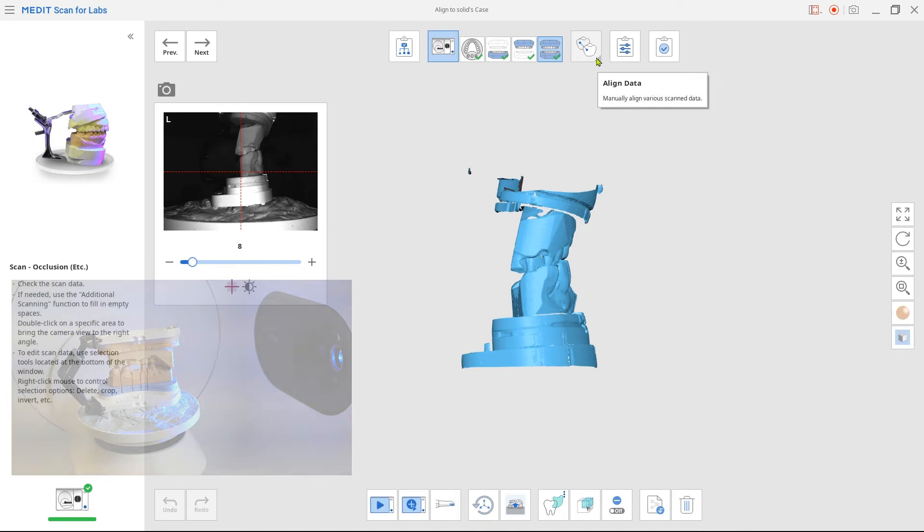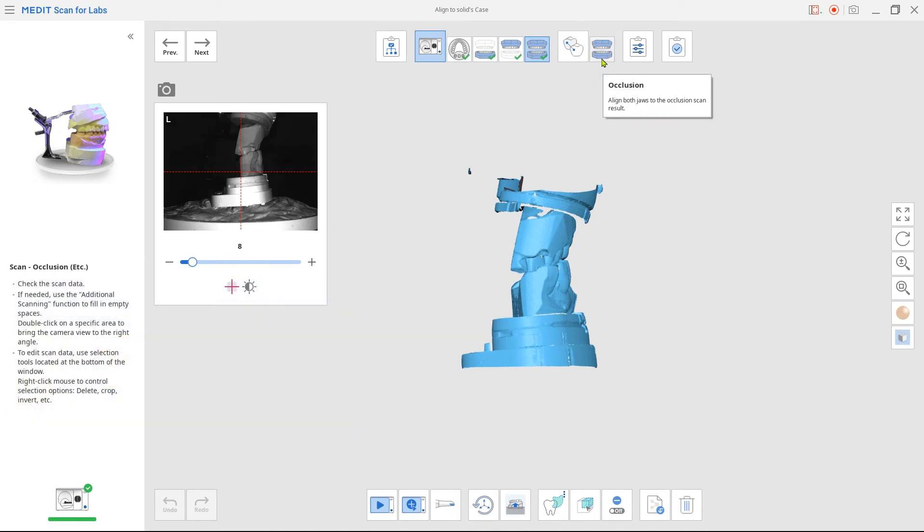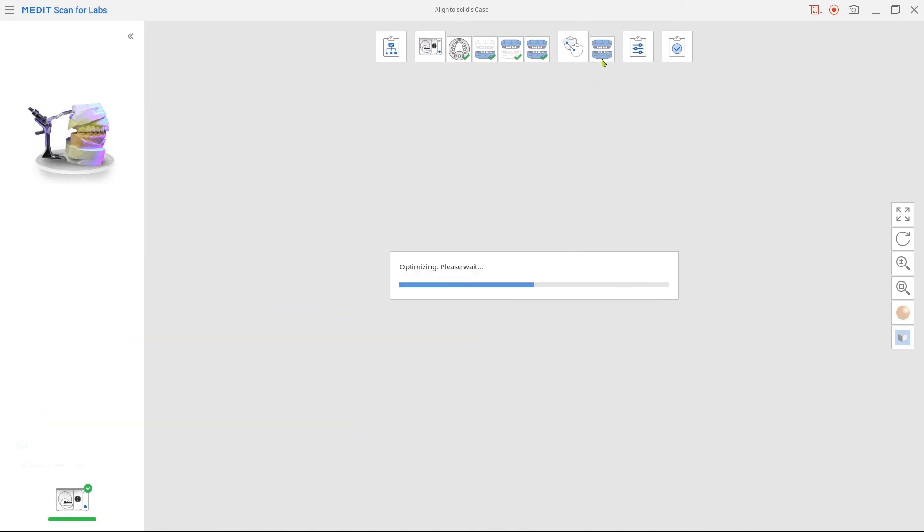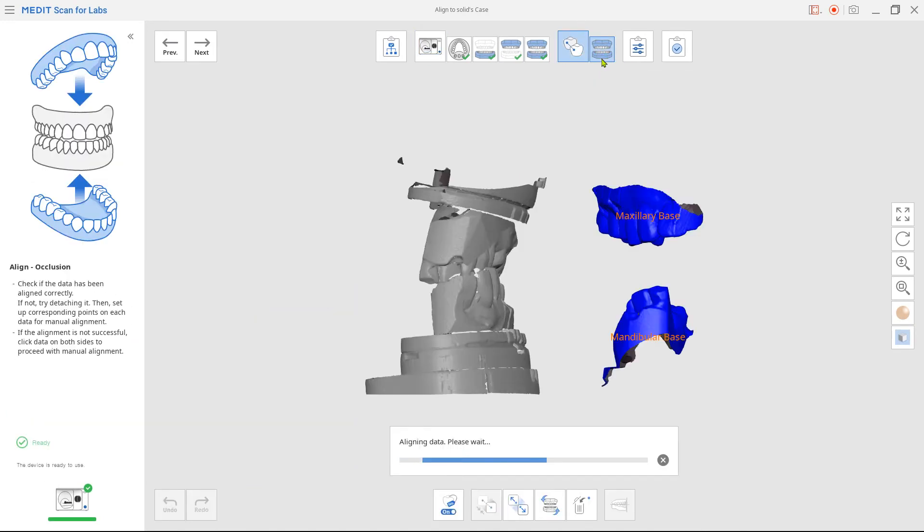Go to align data and click on the occlusion. The system will automatically merge them to occlusion scan.